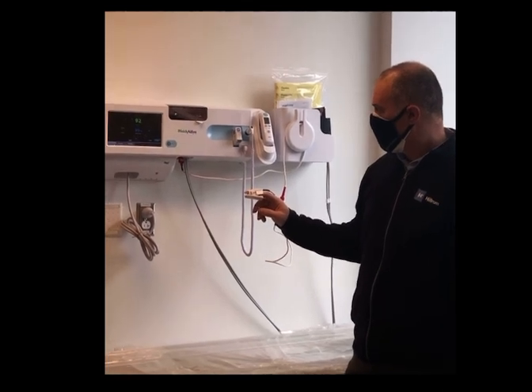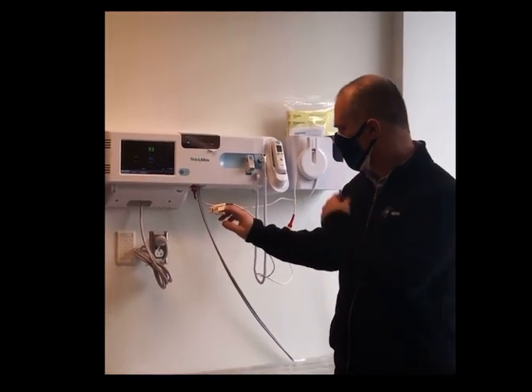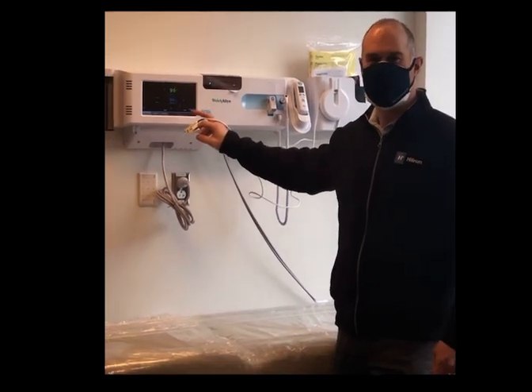91 — you're good? Yeah, I'll take that. It's like a perfect... SPO2, 99, wow.